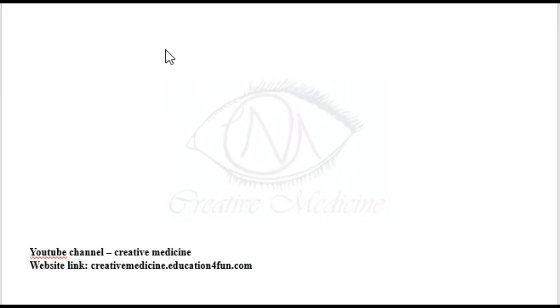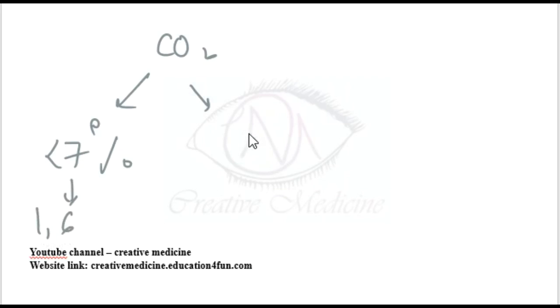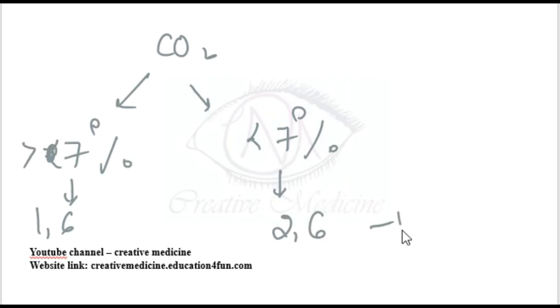The pin index of the carbon dioxide cylinder is of two types. If the carbon dioxide cylinder contains more than 7% concentration, then the pin index system is 1,6. If it contains less than 7%, then the pin index system is 2,6. So the pin index system of the carbon dioxide cylinder, if the concentration is more than 7%, is 1,6. If the concentration of carbon dioxide is less than 7 percent, then the pin index is 2,6.